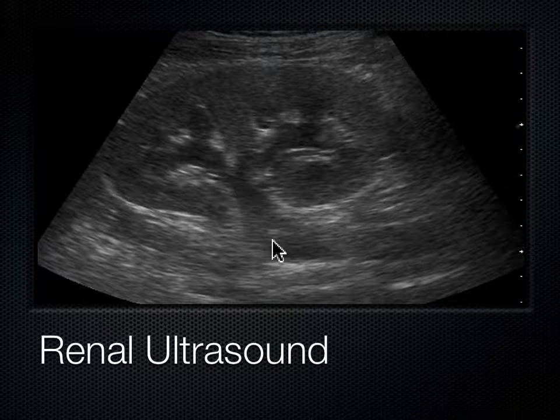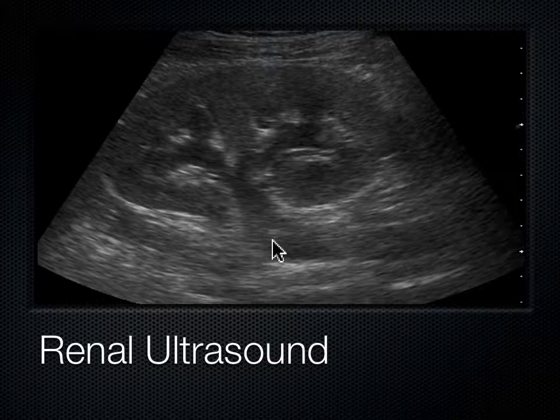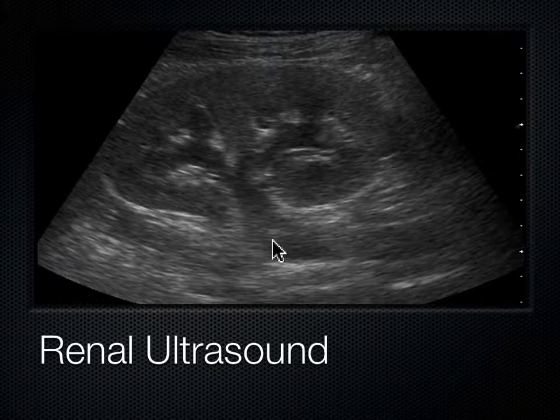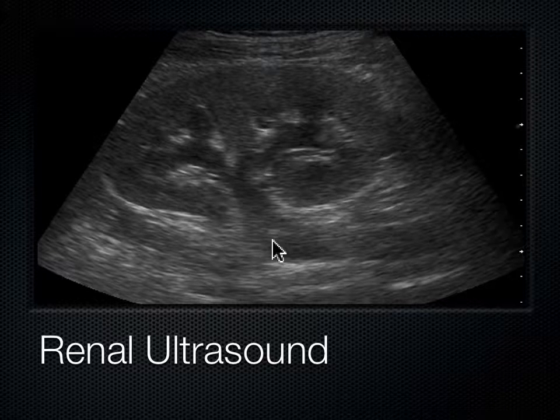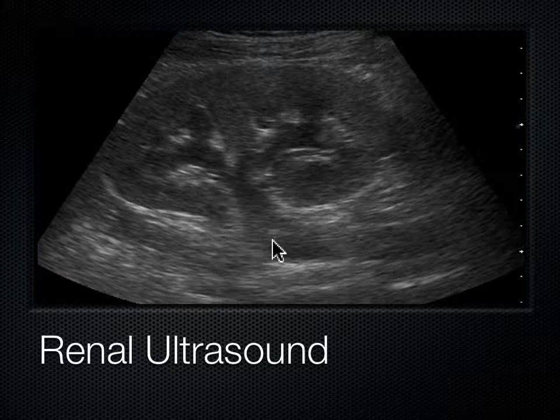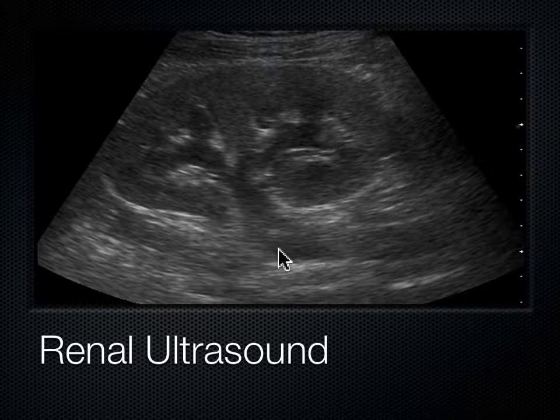The ureter comes down one from each kidney, they come down and enter into the bladder in the back. You don't see the ureters very well on ultrasound because they're covered by bowel and fat. They're very small usually, unless they're dilated, then you can see them. Once the ureter exits the kidney, we no longer see it.